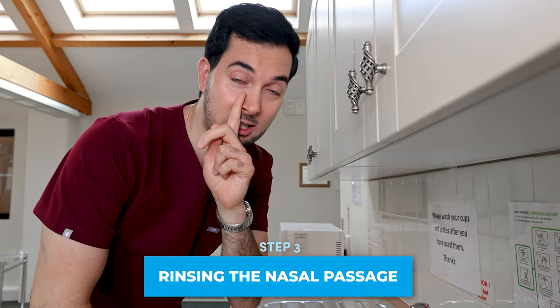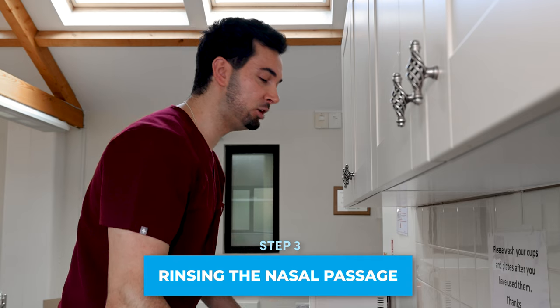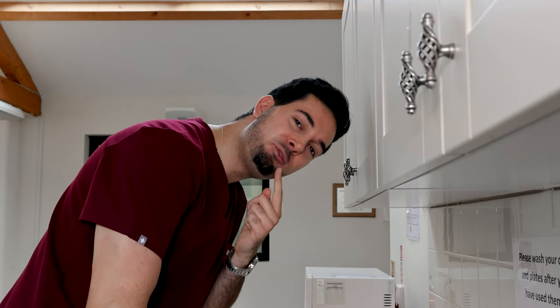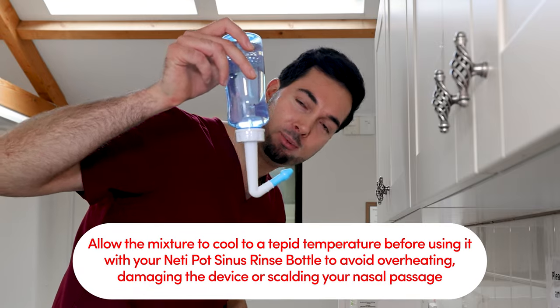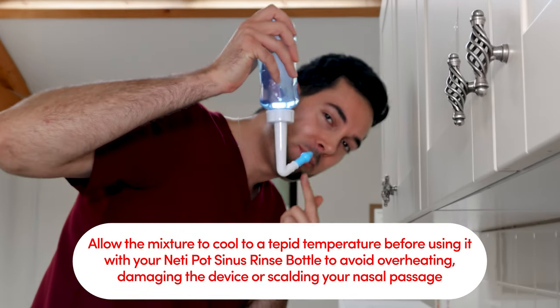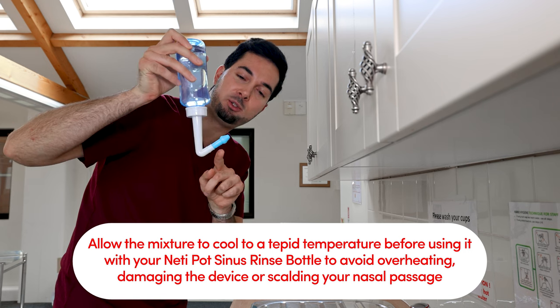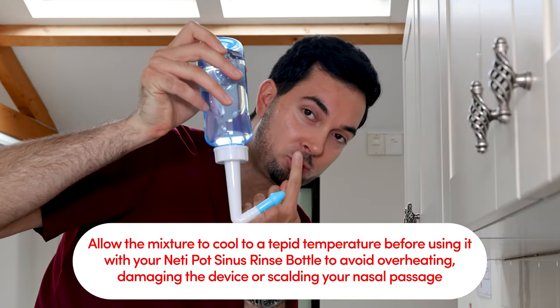Step three: rinsing the nasal passage. We're going to start with the right nostril. Tilt your head forward and to the left, and make sure you leave your mouth open slightly because you're going to breathe in and out from your mouth only. Hold the neti pot sinus rinse bottle upside down and put the tip firmly in your right nostril.